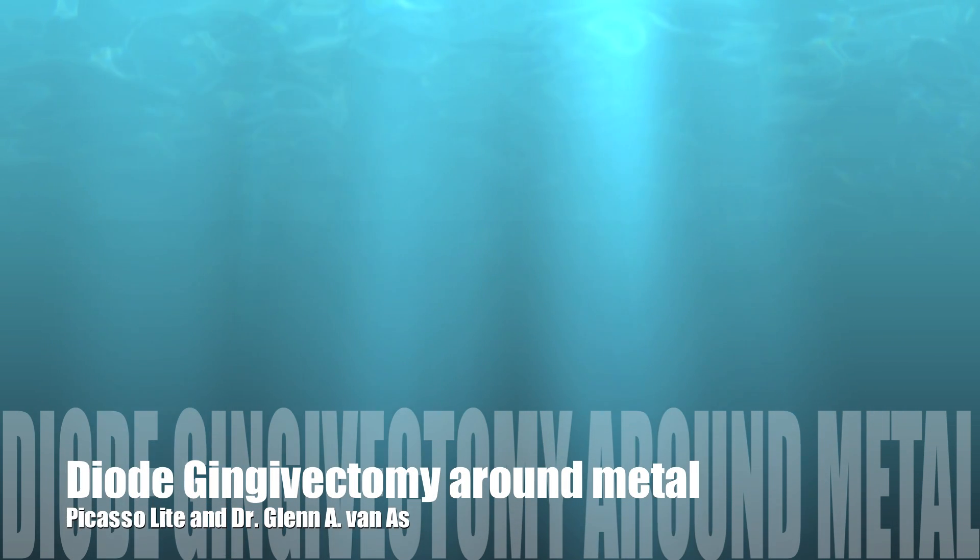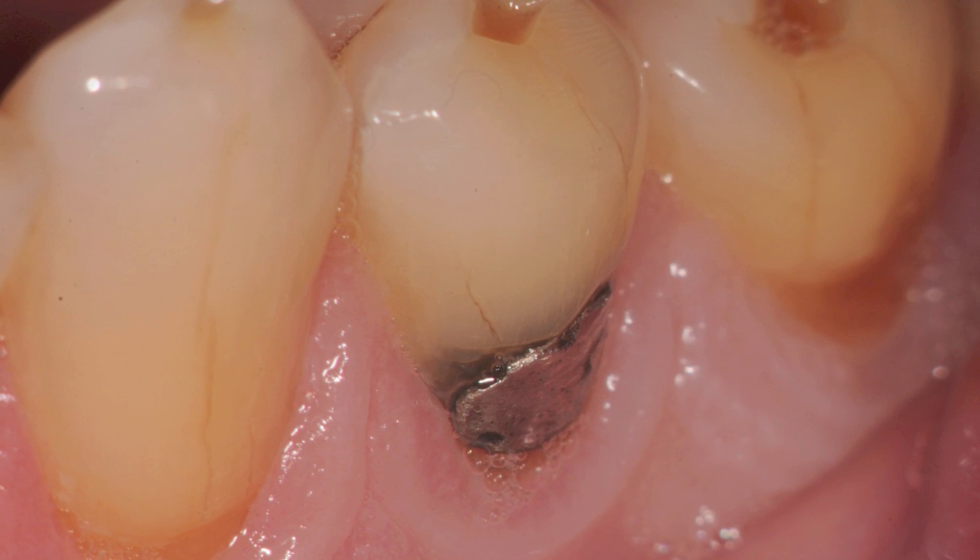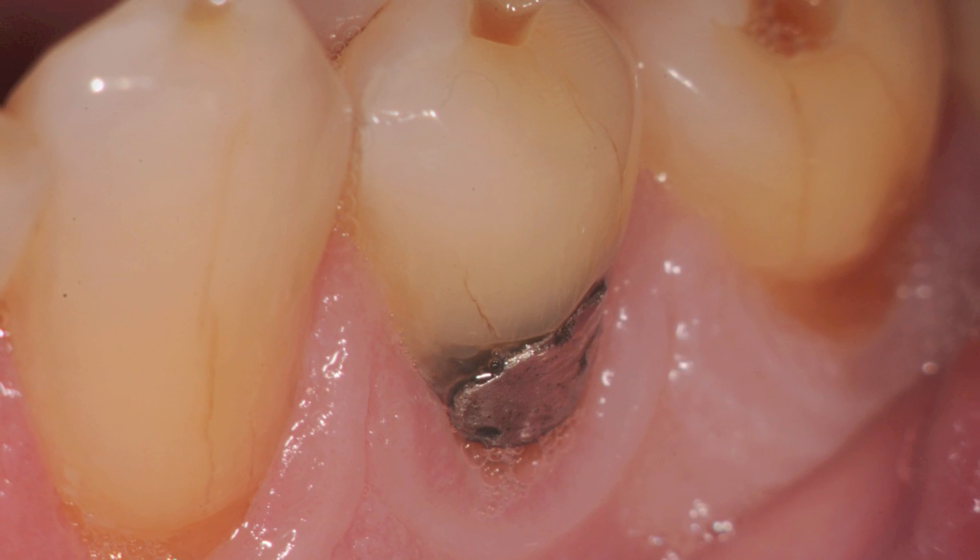Hi there, this is Dr. Glenn Vanass with another case of Lasing is Amazing. Today we're going to talk about a diode gingivectomy. What we see here is a lower premolar with an amalgam that needs a replacement.